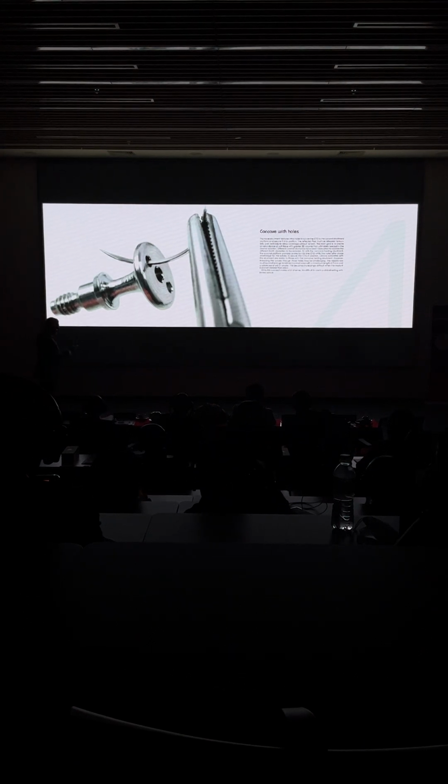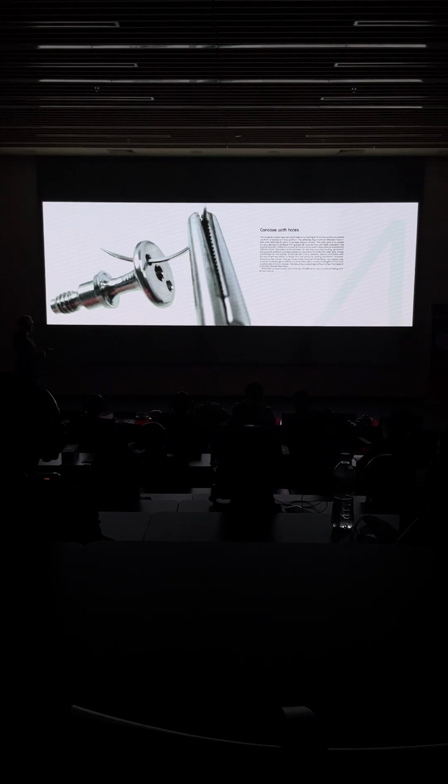We had two versions of this healing abutment. One was a hole. The problem with the hole is that the pitch of the threads of the healing abutment doesn't correspond to the pitch of your implant. So this could end up on the mesial aspect, difficult to suture. You have to suture with a 6-0 suture. It's not for every dentist.